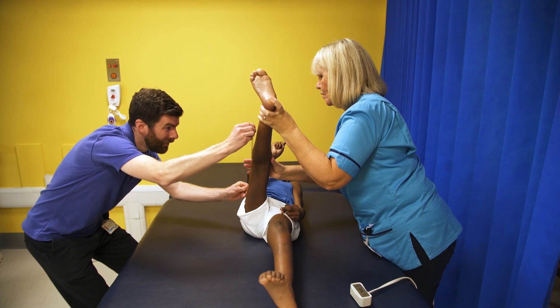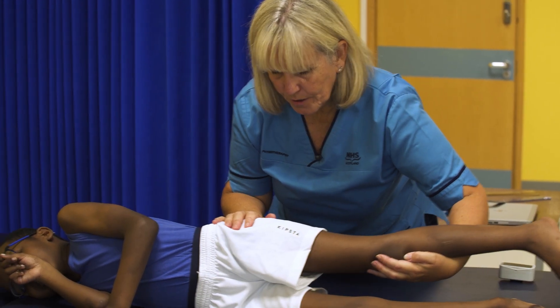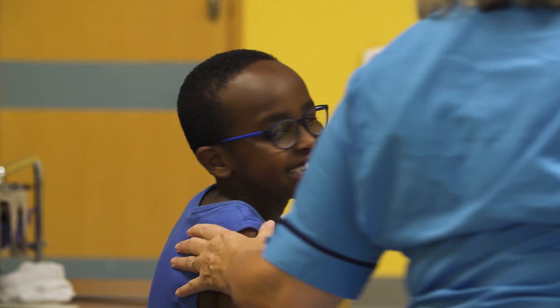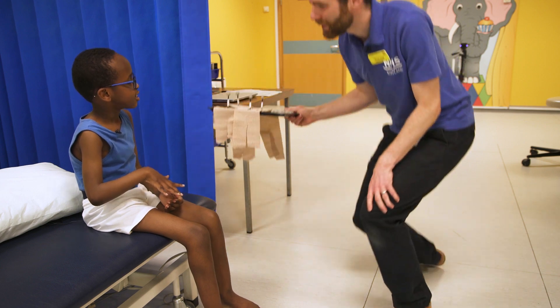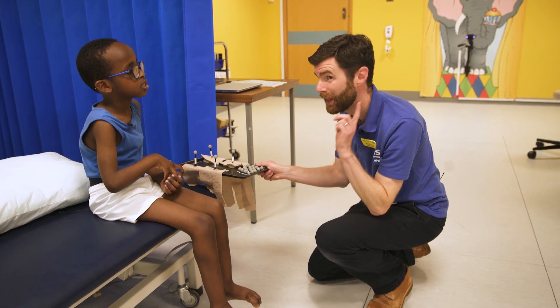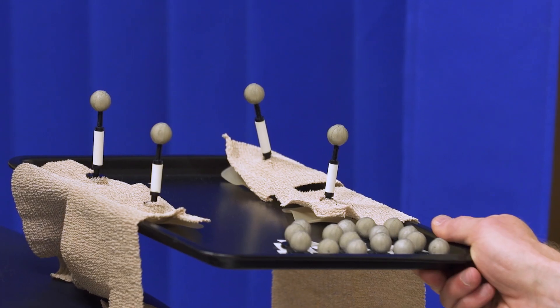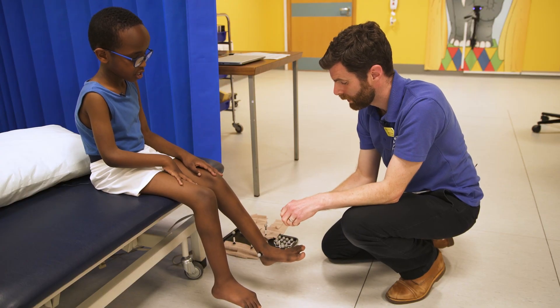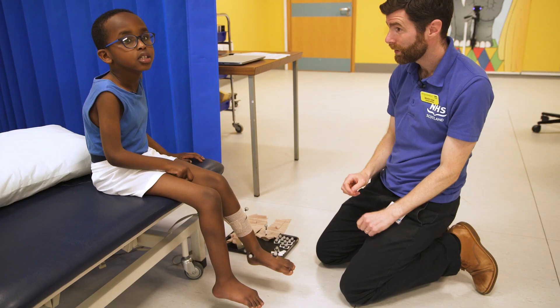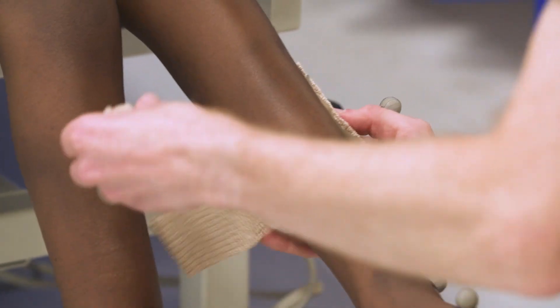We're going to do some bending and stretching and measuring. The next bit of the test — what we want to do is stick these little silver reflective dots onto your feet and your knees and your waist, and then once we've done that we can get walking up and down and do some measurements. What the little reflective balls have got is double-sided tape and it's designed for putting on skin, so it shouldn't hurt when we take them off at the end. It might feel a little bit funny while you're walking to begin with, having all these things stuck on you, but you'll soon get used to it. What we've got in this room is lots of cameras up in the ceiling, and they're going to measure where these little dots are when you walk up and down, and it's going to help us make a little model of how you walk.